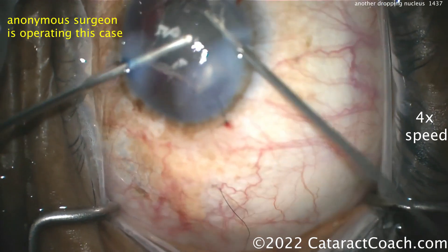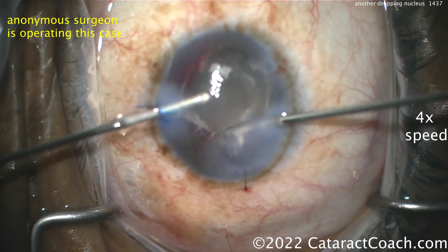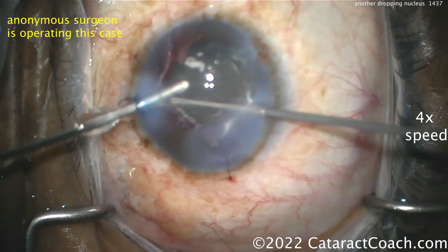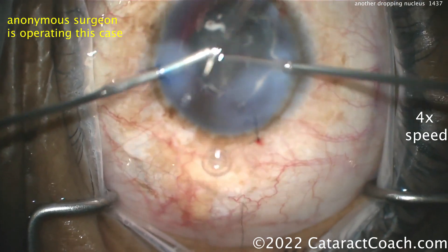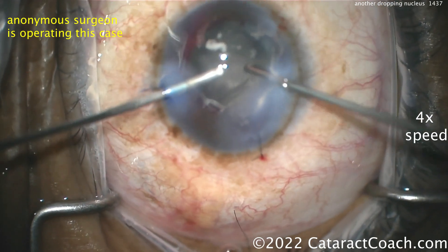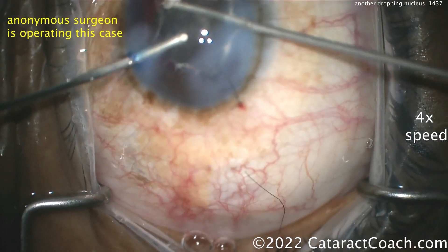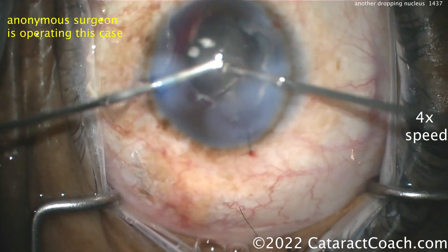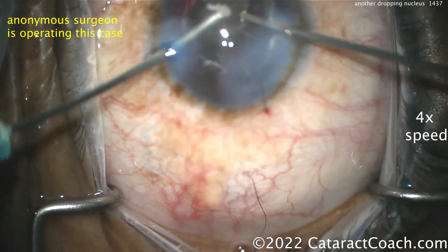Triamcinolone goes in, and you can see there is a lot of vitreous in the front of this eye — a lot. This is going to take time to clean up. The whole video unedited is one hour. Don't think because you're watching this in seven minutes that it's quick — stop, take your time, and do what's best for this patient. The nuclear pieces are already in the vitreous. Let them go.